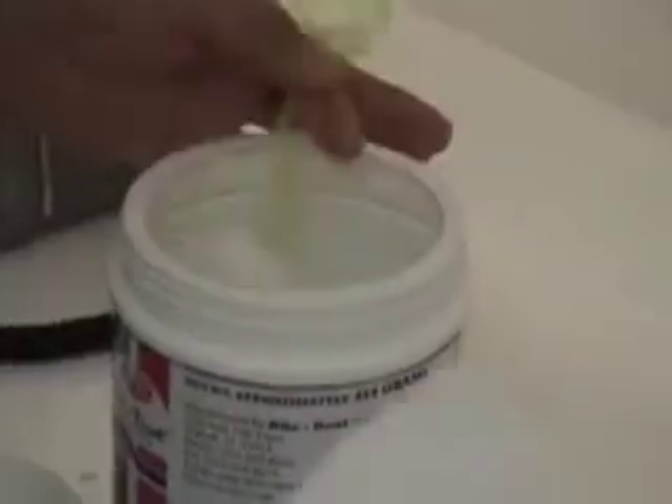Just use your Rydent Alginate, same as Geltrade, available from IDS for as low as $5.50 a pound.